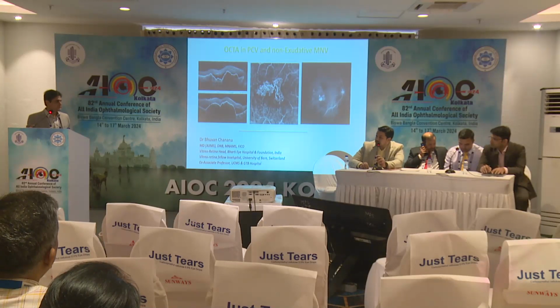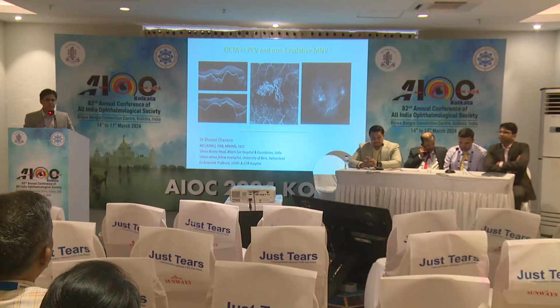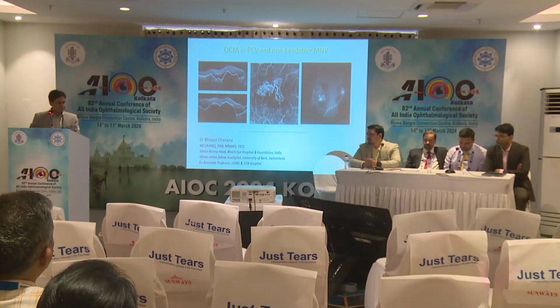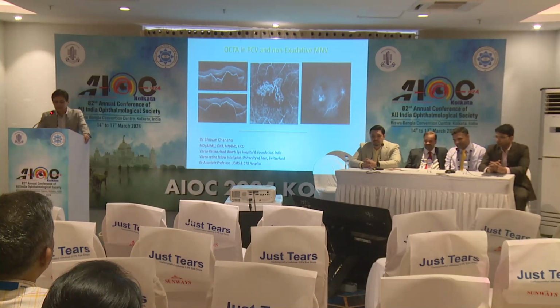So, Dr. Bhuvan, sir. Yeah, so thank you, Ankur, for the introduction. Very good morning to all the chairpersons and audience. I'd like to thank AIOS, I'd like to thank Ankur, and it is a very nice opportunity to meet my old friends. So I think we are discussing OCTA. I think OCTA is the future, but definitely we have discussed the limitations and also the advantages.